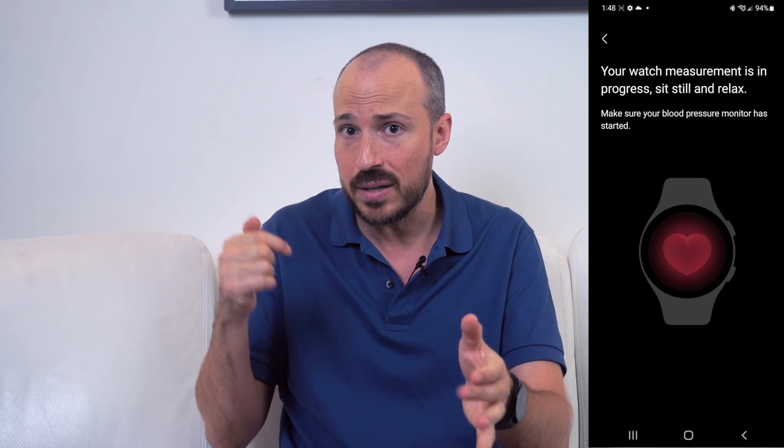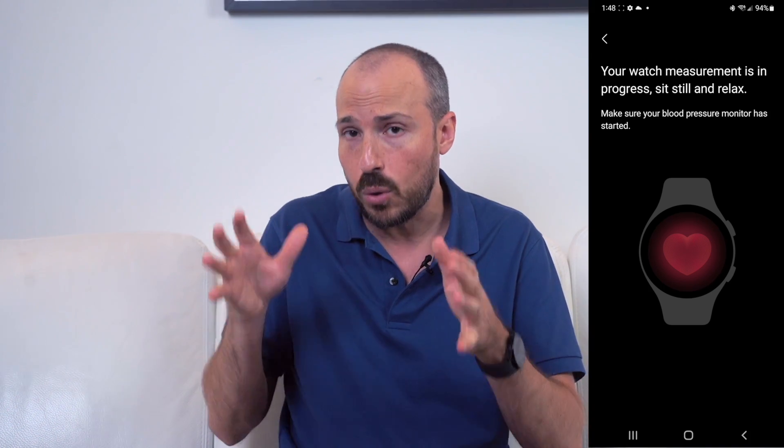When you calibrate for both of these features, it is calibrated for you specifically. It doesn't mean that you've calibrated it and then you can put the watch on a family member or somebody else and get a reading that way — it's not going to work like that. You have to set it up for whoever is actually going to use it. It's not like an actual blood pressure monitor where anybody can use it and get a reading. In this case, it's primarily for you.